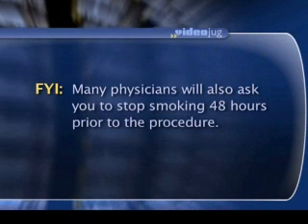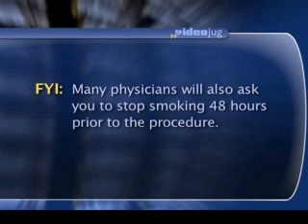Those also require the patient to stay away from or not drink caffeinated products, including coffee, tea, and soft drinks that have caffeine in them, because the caffeine interferes with the effectiveness of those drugs that we use during the procedure. Therefore, the preparation is quite simple, and again, depending upon what type of stress we use, we may ask them to stay away from caffeinated products.